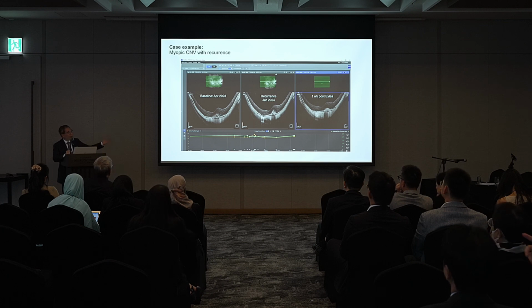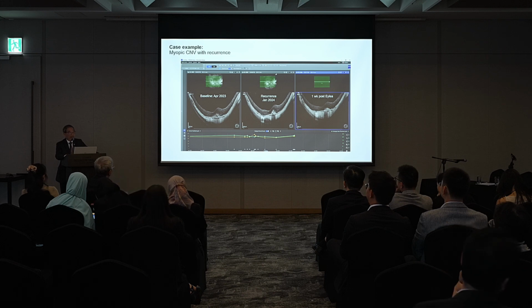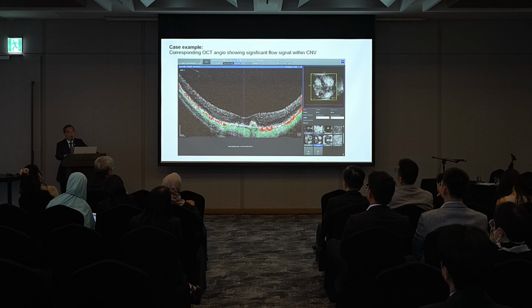This is a patient who started off on the left, recurrence, treated, recurrence about a year later, and after that, a good response to treatment. And these patients are very, very sensitive to anti-VEGF therapy if you catch them on time.